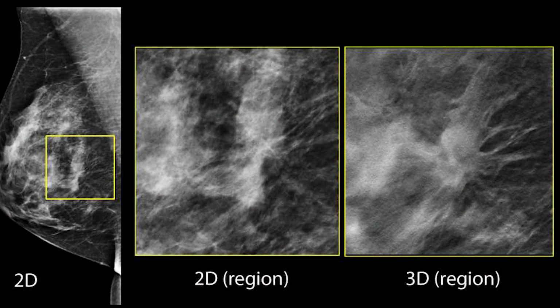So when you get that letter in the mail that says you have dense breast tissue, some of the options you have are, number 1, you should find out if you just got a normal 2D mammogram, which is the standard mammography right now. But a lot of facilities offer digital breast tomosynthesis, also known as 3D mammography, and that's definitely better for women that have dense breast tissue. So you want to find out if you got digital breast tomosynthesis or a 3D mammogram.